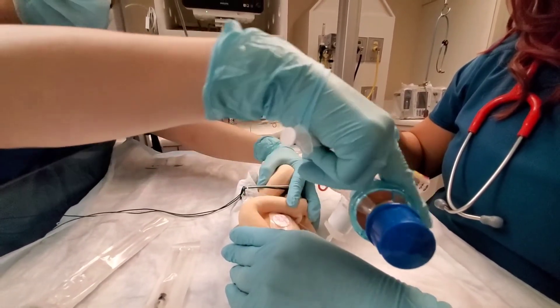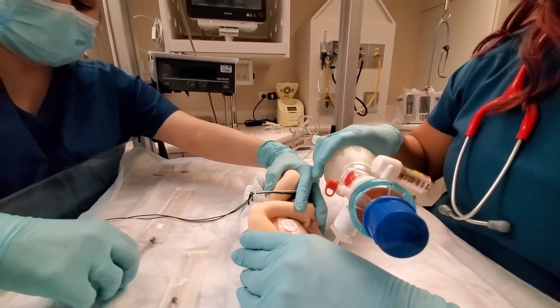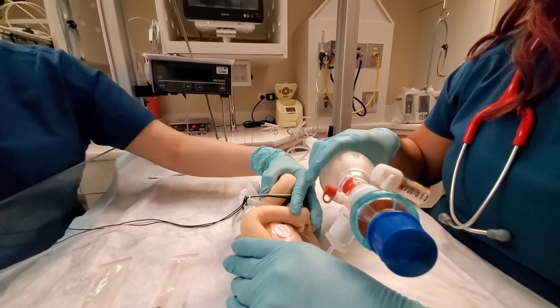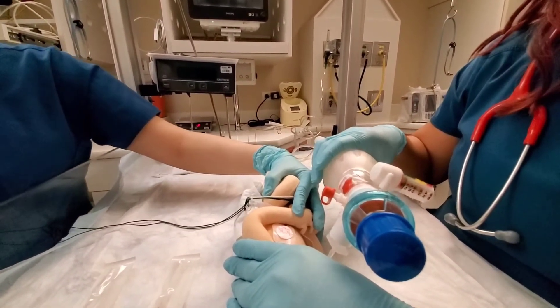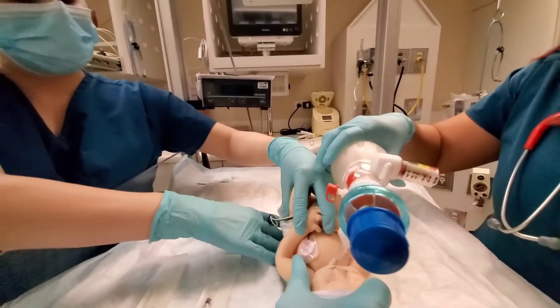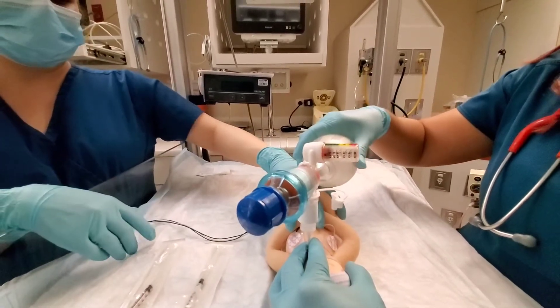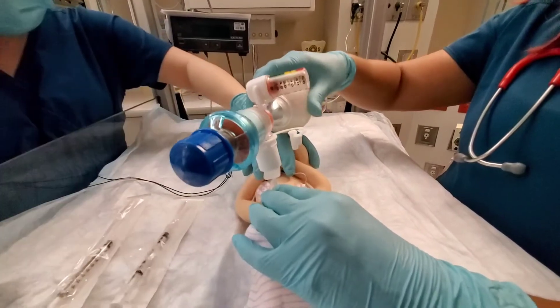So there we go — it's in, and it's been almost 30 seconds. So it's been 30 seconds. Baby's being log rolled back to supine. The hand is still on the baby, making sure that he stays contained and stable.